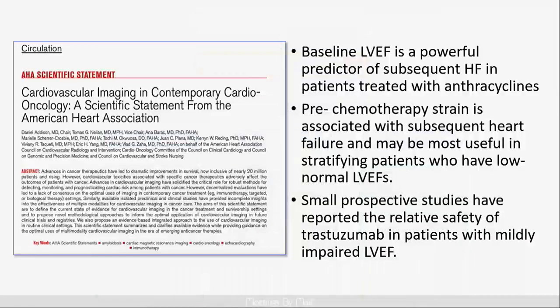And it has been established in the guidelines that while left ventricular ejection fraction continues to remain a powerful predictor and is used specifically in people who are asymptomatic, use of three-dimensional ejection fraction, 3D echo-derived ejection fraction, or if 3D cannot be done, then biplane 2D or other MRI whenever the echo is not available or not good in quality.